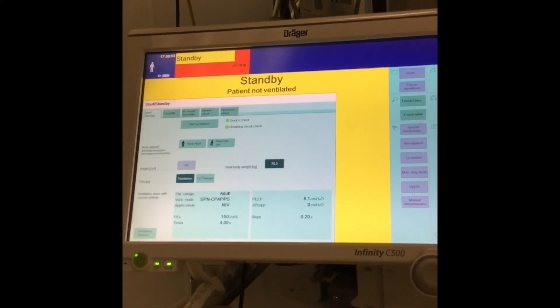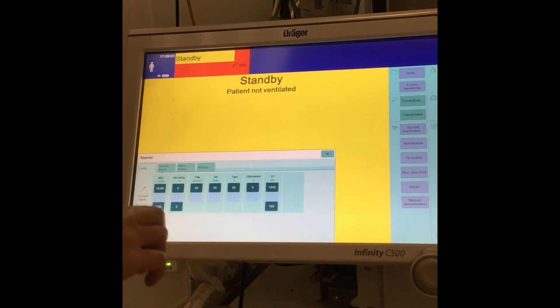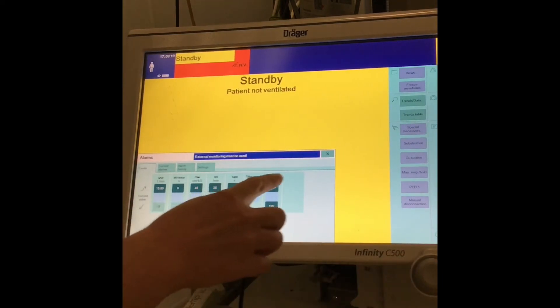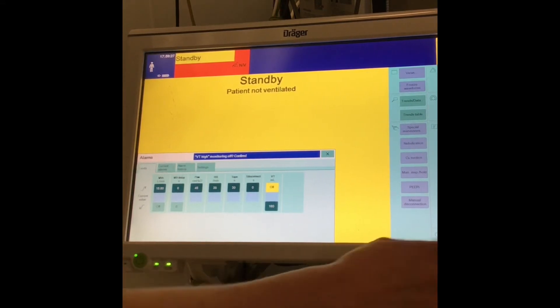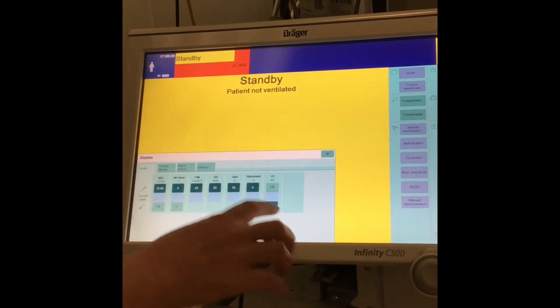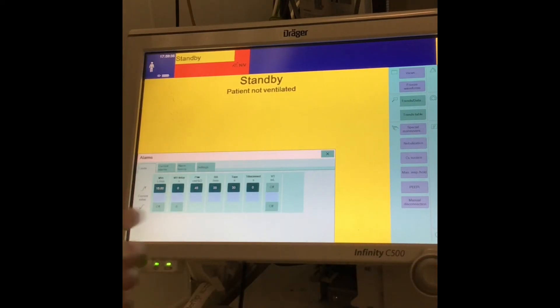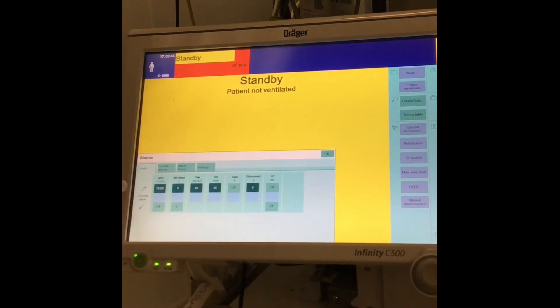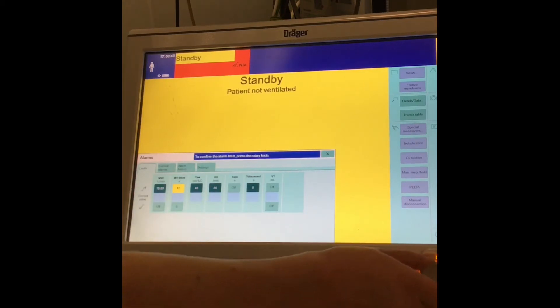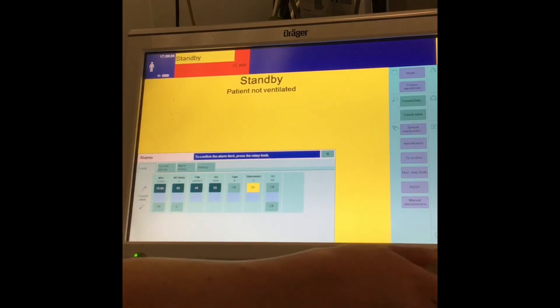The thing to be mindful of with NIV is that the alarms need to be set to certain things and some things need to be switched off. Go to alarms: the minute volume needs to be switched off, upper tidal volume needs to be switched off, lower tidal volume needs to be switched off, upper apnea time needs to be switched off. Minute volume delay needs to be set to 30 seconds, and disconnect needs to be set to 30 seconds as well.